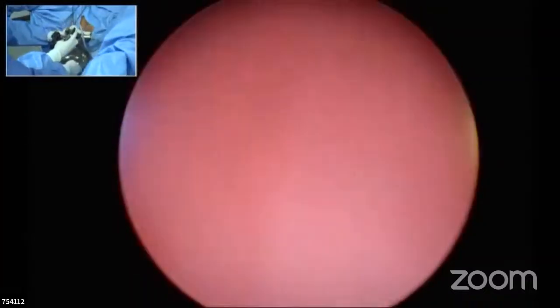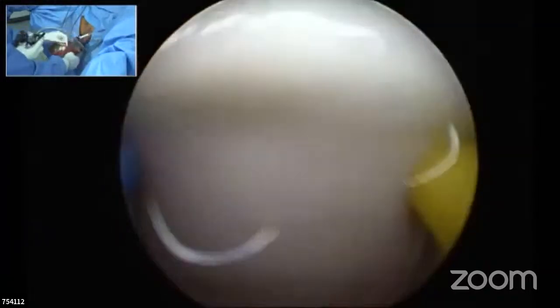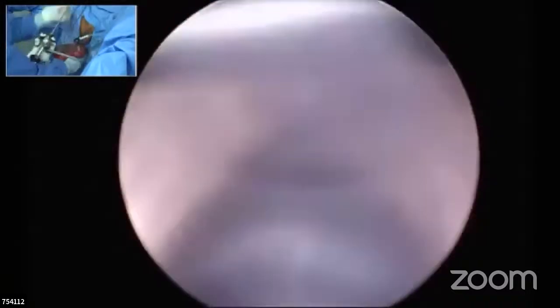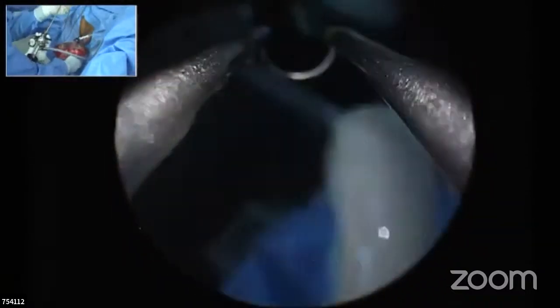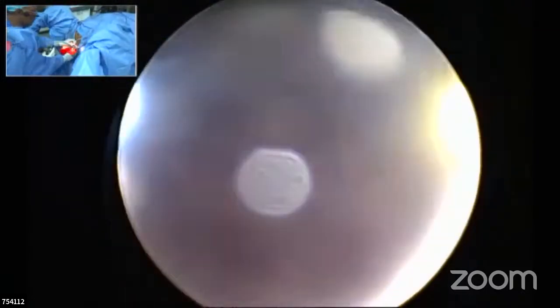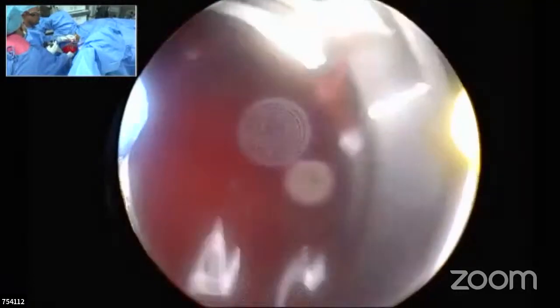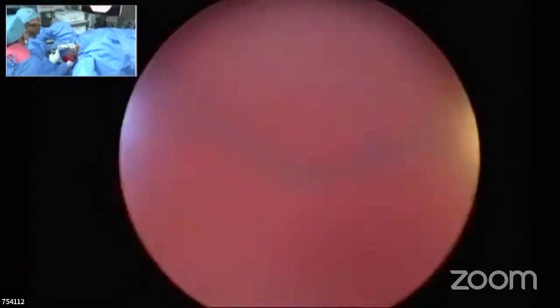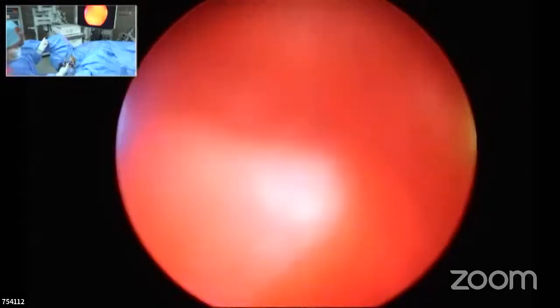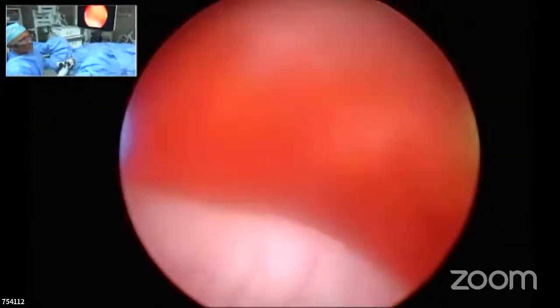Your comments, sir. What are your settings? Sir, this is an automatic setting. Once you put a loop in, the setting automatically comes into picture. So it's a bipolar automated setting by the company, and we don't really manipulate it at all. But what does it show on the machine? You're cutting at 240, 200? 200 to 120, sir.